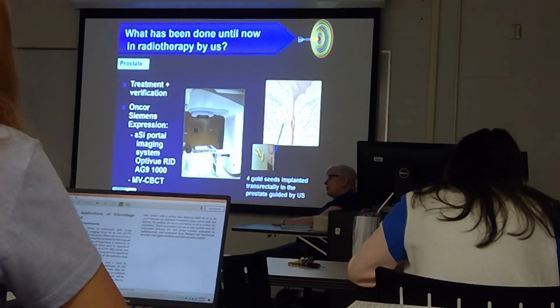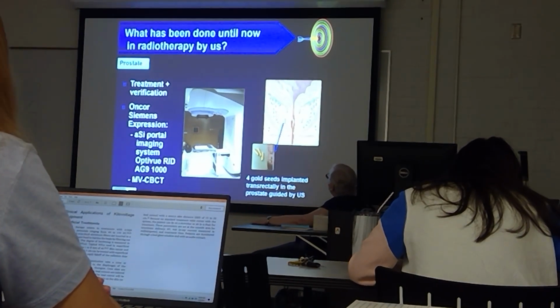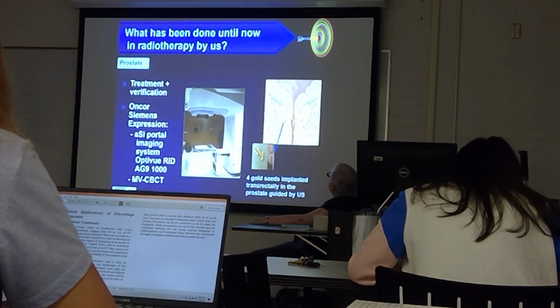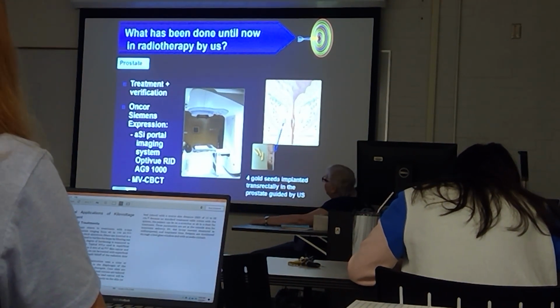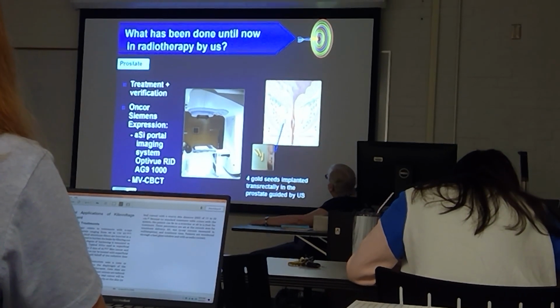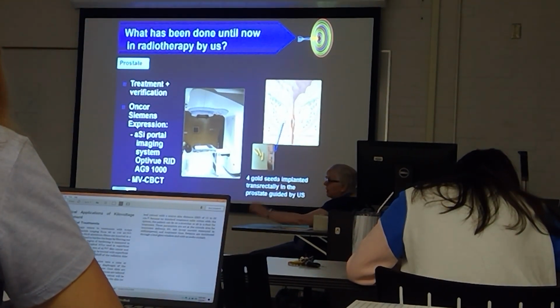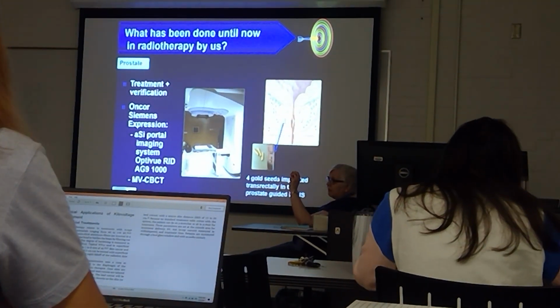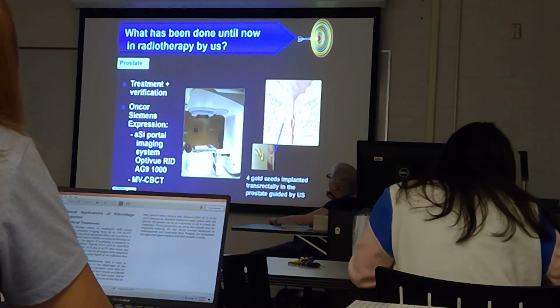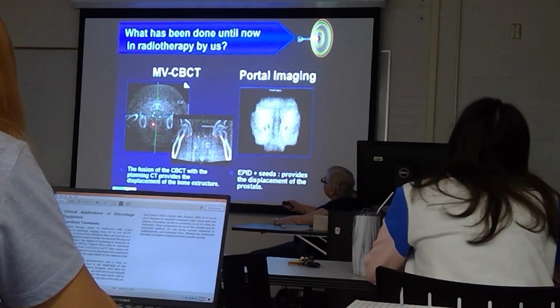You're looking very quizzical. I'm trying to figure out, are those seeds around the outside of the prostate? No, in the prostate. Like where are those blue dots in the yellow outside of the prostate? That's, I think, supposed to be just soft tissue. Oh, okay. So this is the prostate here. These 4 little things are the seeds, and they're only tiny. They're about this size. So here are the seeds.